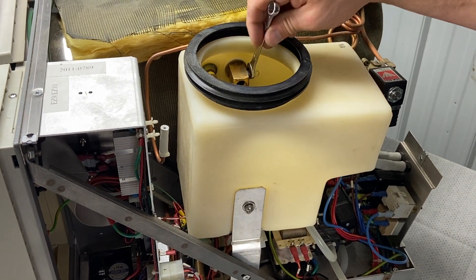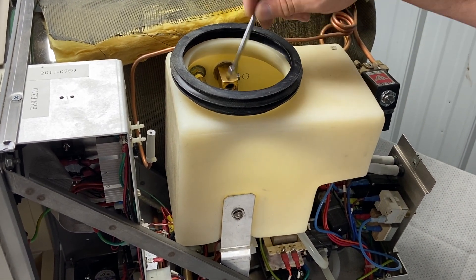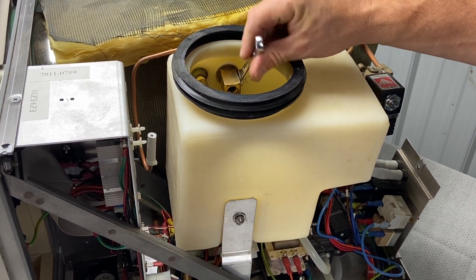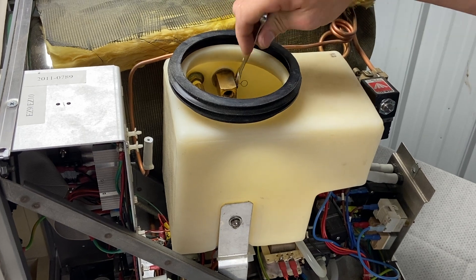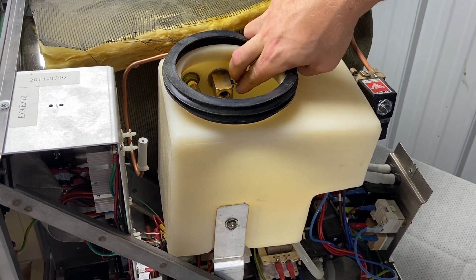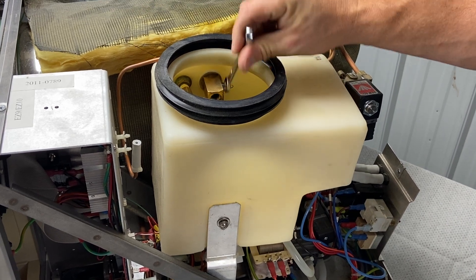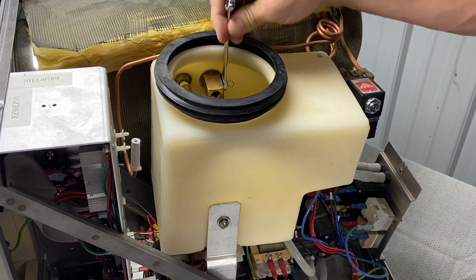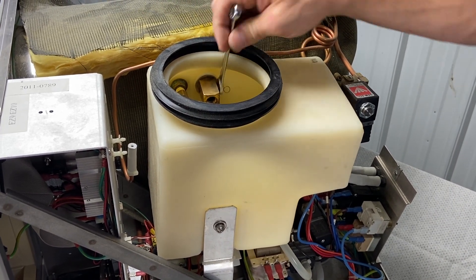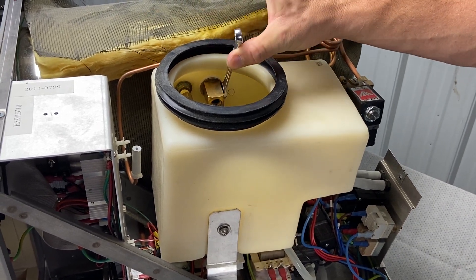I did not put Teflon tape on the air jet. You can, but when you're screwing it on, the Teflon tape might come loose and may not even be there by the time it's fully threaded, leaving dangling strands that fall into the reservoir. As long as you tighten it down all the way, it's fine. This thing is supposed to leak — it's a metering air jet, so it spits out steam as the unit is building pressure, which protects from overheating or over-pressurizing.